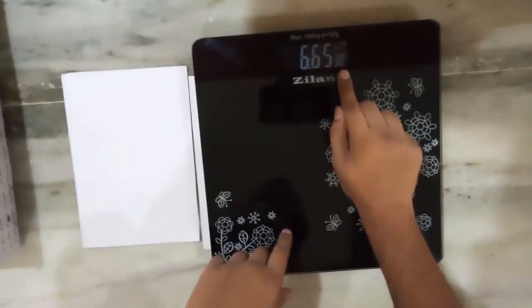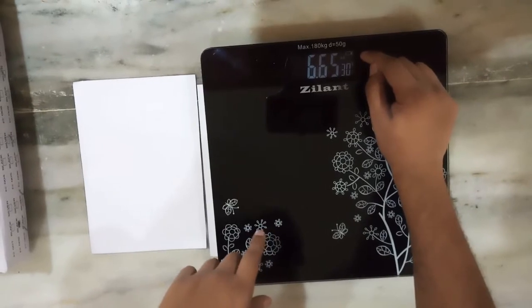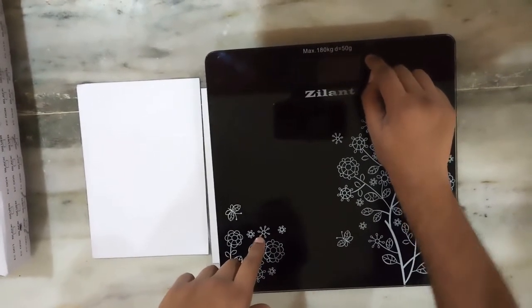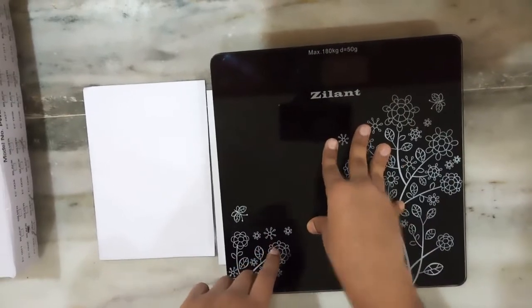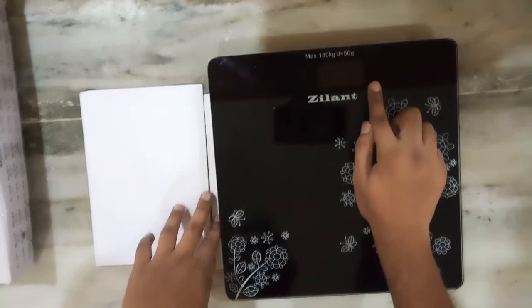Here we can see the temperature is also visible, and the battery level is also indicated. So this is a very nice feature — the battery level. I liked it very much. And also the temperature is pretty accurate most of the times.